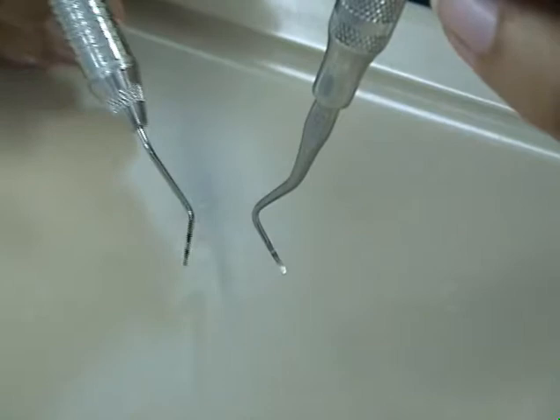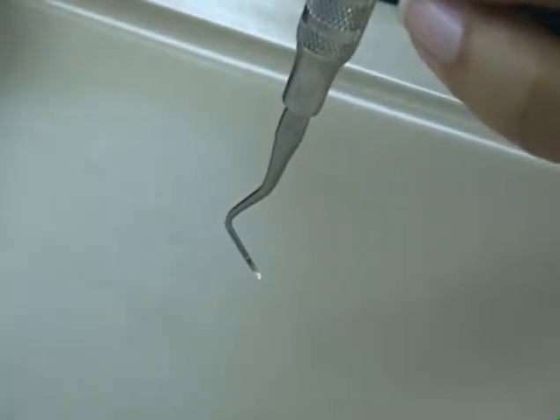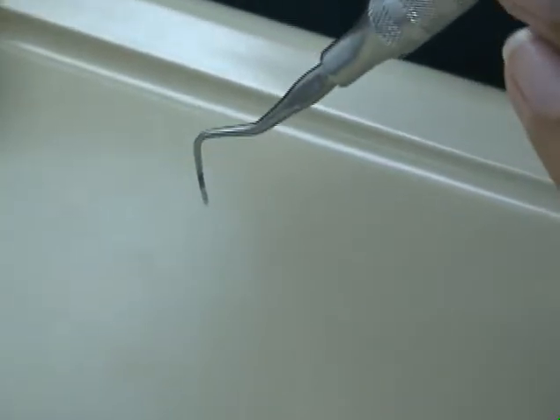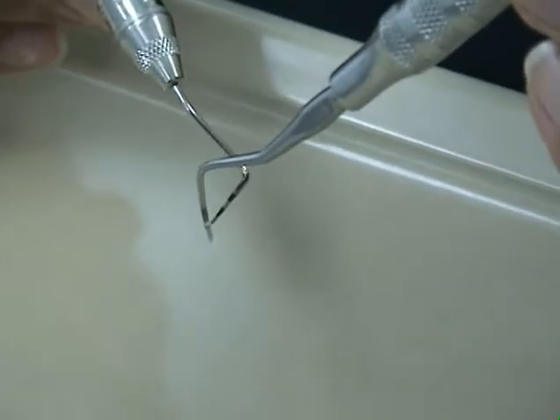To identify the cutting edges, hold the instrument so that you are looking at the face of the working end. The outer cutting edge is the one that is farther from the instrument handle. The inner cutting edge is the edge closer to the instrument handle.